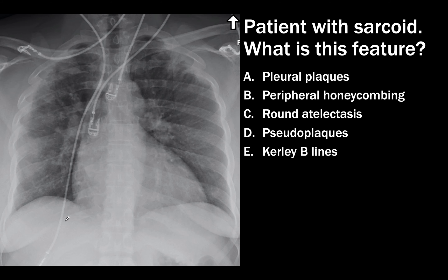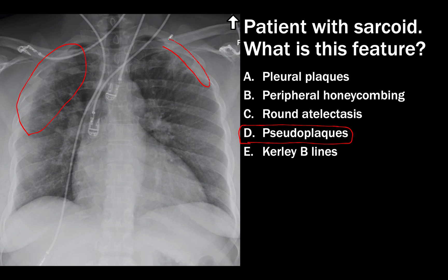Case 38. The patient has sarcoid, and the question asks what this feature is. From the Fleischner glossary, this is called a pseudoplaque. It looks like pleural plaques, but given the history of sarcoid, this abnormality is not in the pleura — it is in the subpleural part of the lung that abuts the pleura. It represents countless tiny sarcoid nodules conglomerating together along the pleura to form what looks like a plaque.